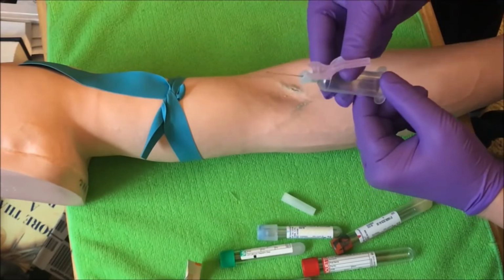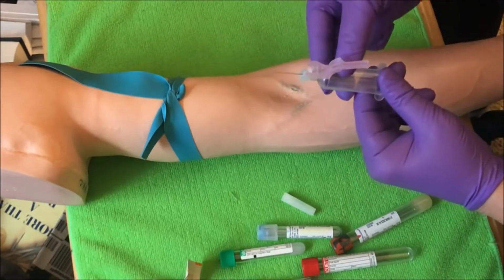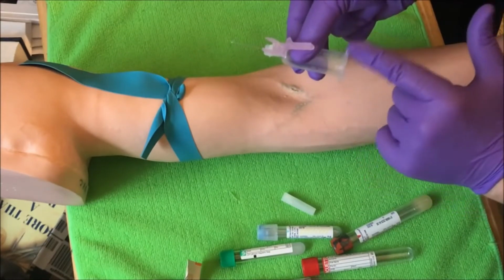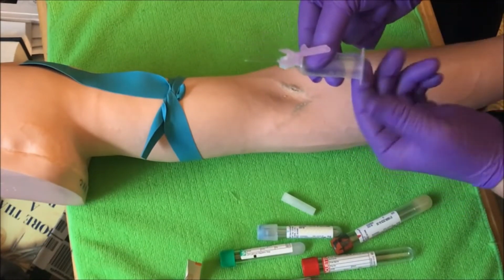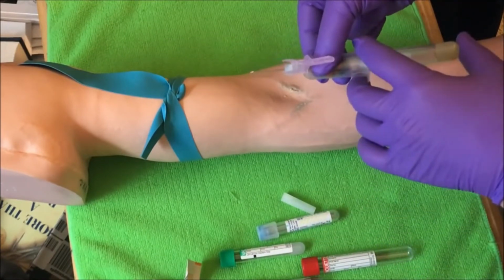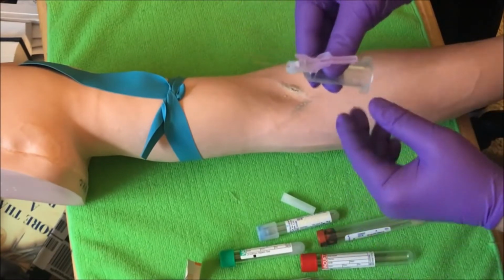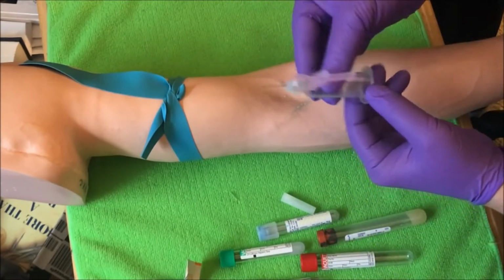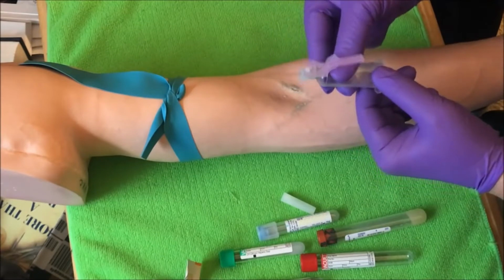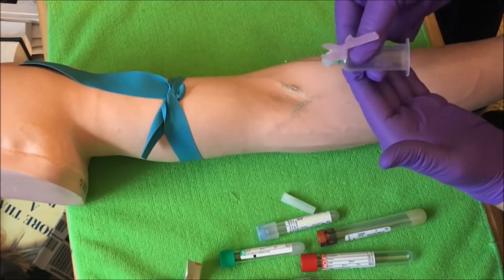I always hold this 2 fingers and a thumb. Everybody holds it differently. For me, the most comfortable way is 2 fingers and a thumb. I'm leaving enough room here in the back for my tubes so I can get my tubes in and out, which I'll show you, so they're free to use the little phalange grip here to push in. So I like to use, of course, 2 fingers and a thumb, leaving enough room here, and I feel more comfortable, so that when I'm ready to go in, I have a perfect set spot for my fingers.